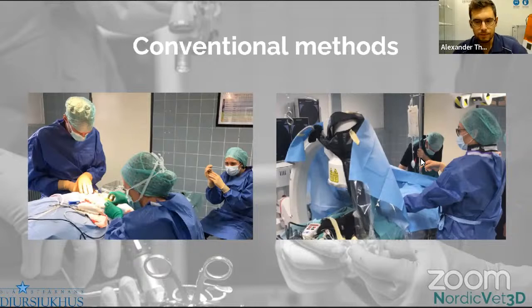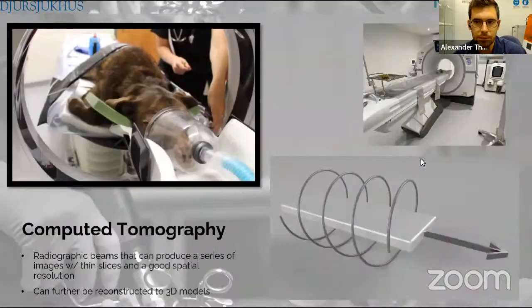And without the 3D guiding system, we put in screws and pins blindly in most cases, and then we do it with safe margins. Which in consequence will lead to less stable placement or fatality, which we're going to talk about a little more later.